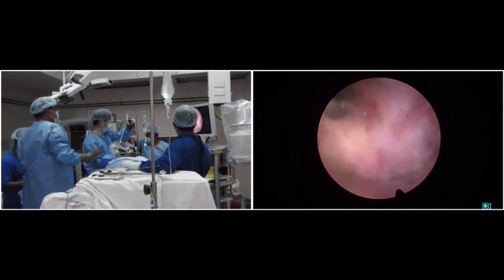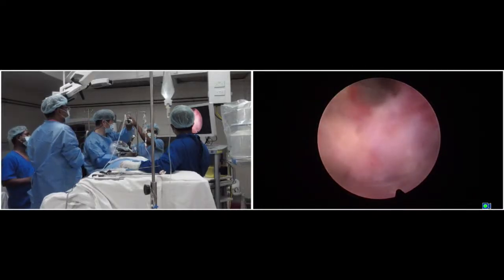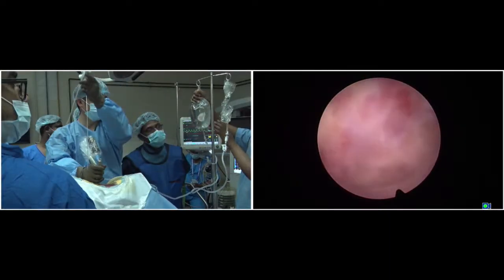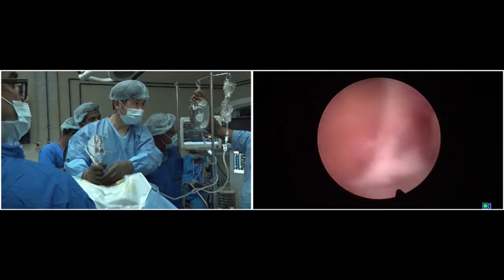Okay, here around the nerve. Here is a pedicle here. Okay, drill.